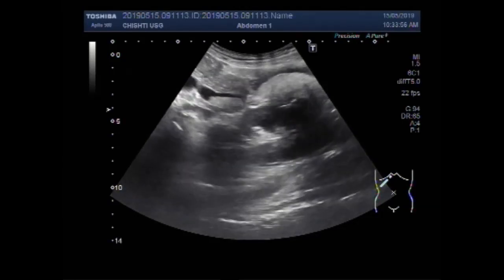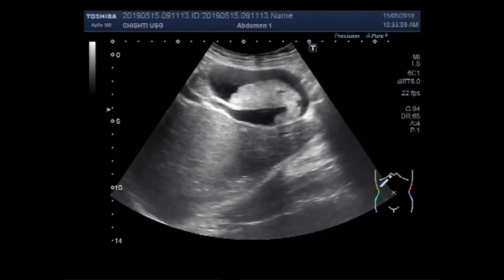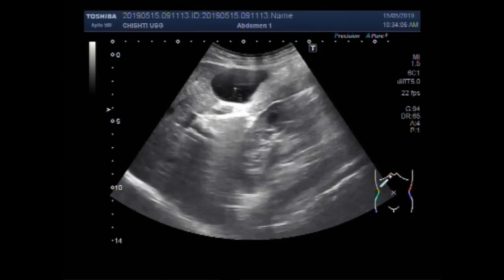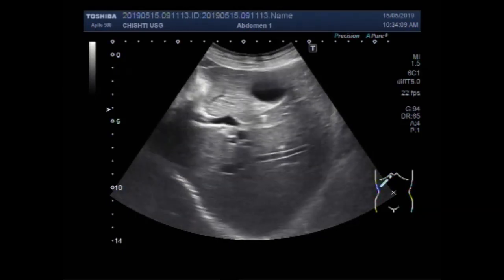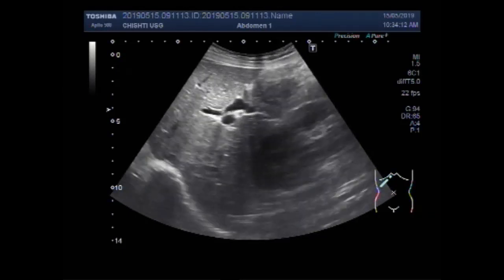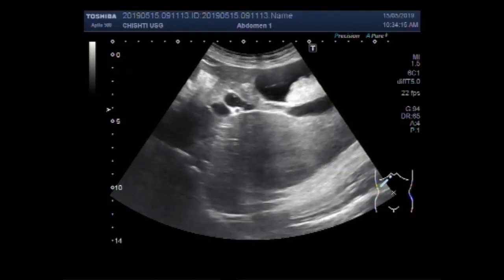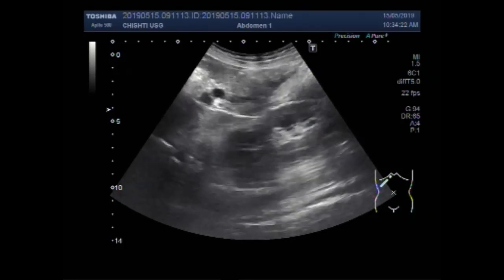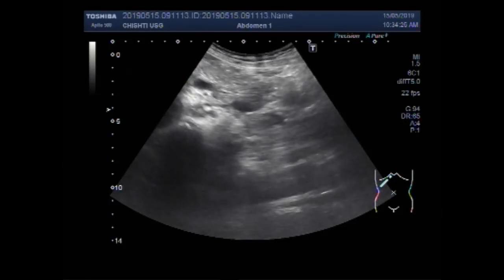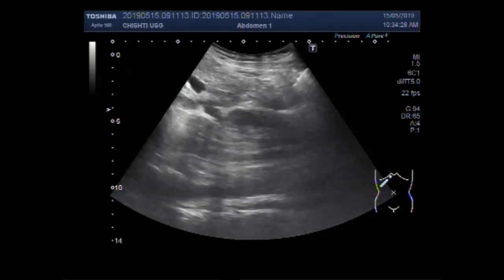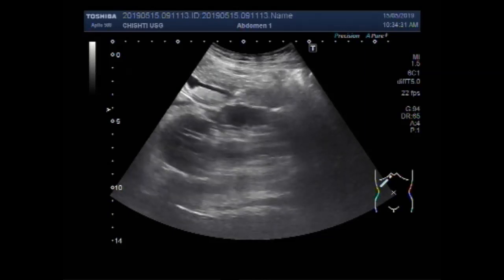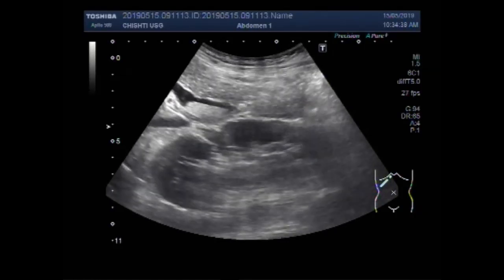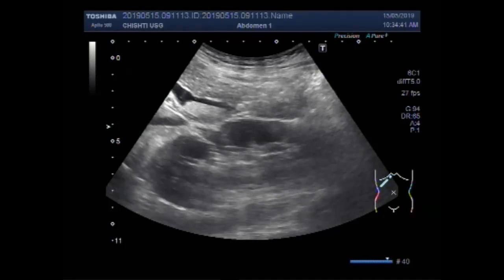The biliary ducts are dilated. Again you can see the biliary sludge along with the gallbladder sludge. This is the biliary sludge, and stone shadowing is also seen inside the bile duct. Now you can see the stone as well as the biliary sludge.